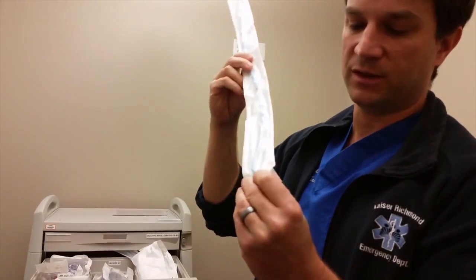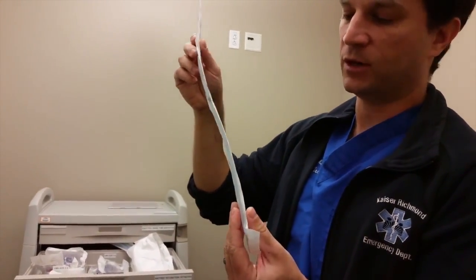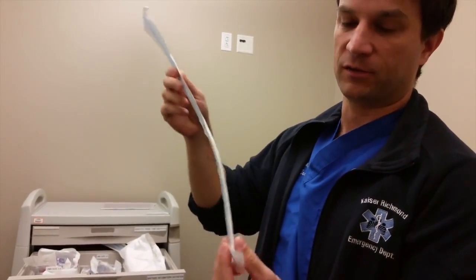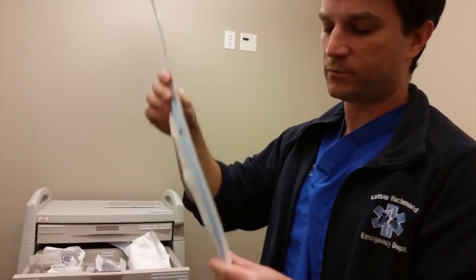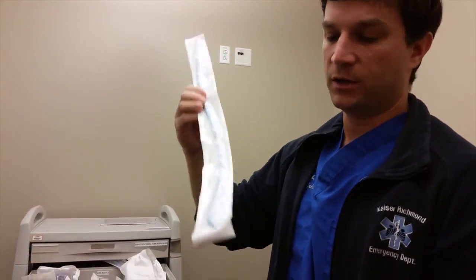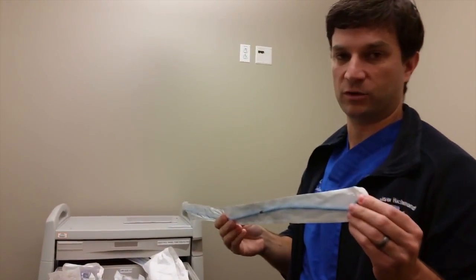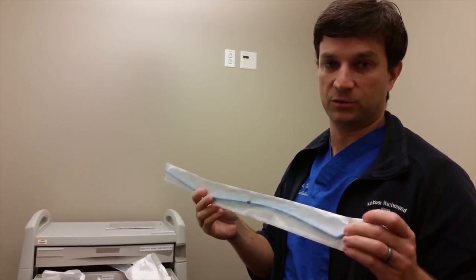You can feel the tip click along the tracheal rings, which gives you some verification. And oftentimes people will push this in until they get a firm stop at the carina, as opposed to going in the esophagus where there would be no firm stop and just keep going to the stomach. And then you can use basically a Seldinger technique like you would with a central line and use this to then pass an endotracheal tube right over. So this is a great first backup option, and often the first thing we'll go to when somebody's having trouble either locating the glottis or passing the actual physical tube in.